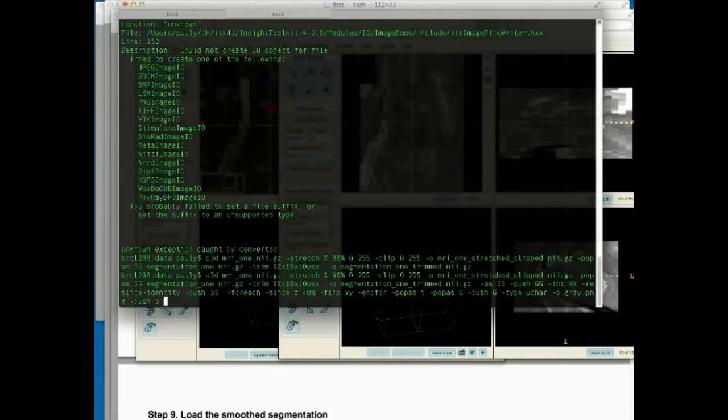We're going to push back the segmentation, and here's the other command, the OLI command. What that does is it takes a label image file, in this case snaplabels.txt, which defines what color each label is going to be. That's something Paul also talked about in the morning, where you give different colors and you can save out a label description file. That's what this is. And the 0.5 is just the transparency of the label overlay that you want in your final output.